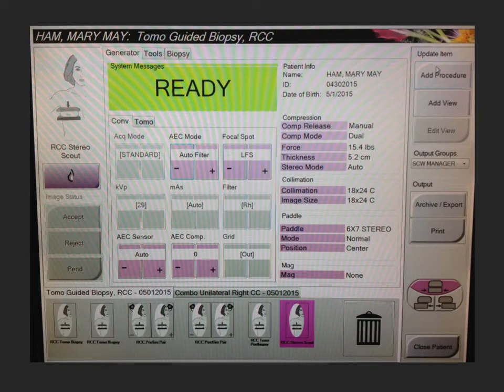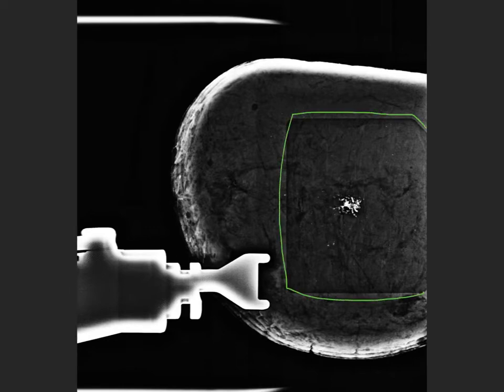This is the Hologic tomobiopsy unit screen and we're pretty much always going to start by doing some form of a scout depending on the projection to just make sure that our lesion was in the field of view. So here's our scout image. You just want to check the borders of the paddle opening to make sure that your lesion, seen very clearly here, is well within those borders. And then you go on and do the first tomo image for targeting.